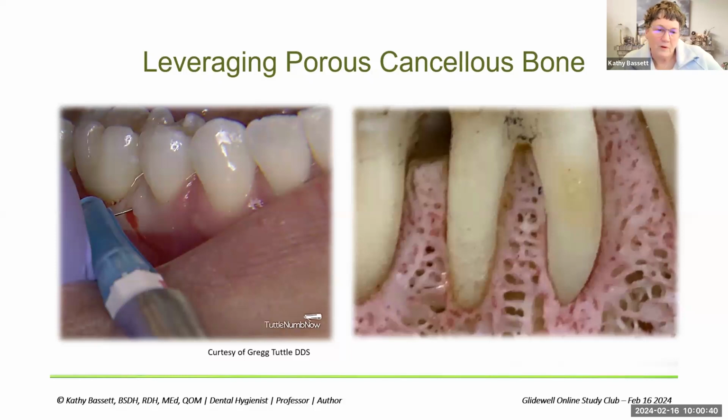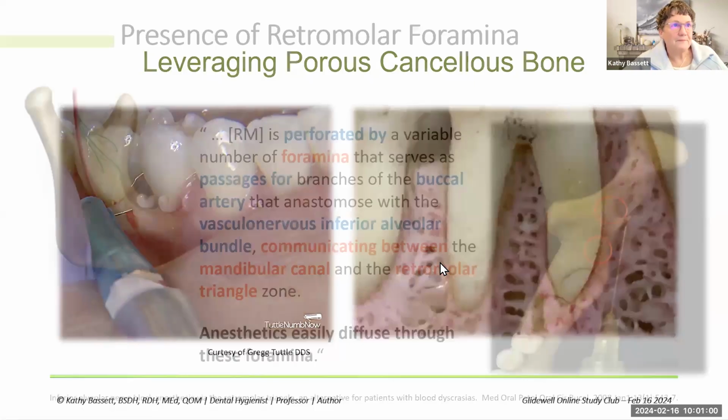And the most important learning for me was the understanding that when you're choosing your insertion site, we're literally using the gingival margin as our line up for that. But again, once you get the injection in there, very limited resistance to that.